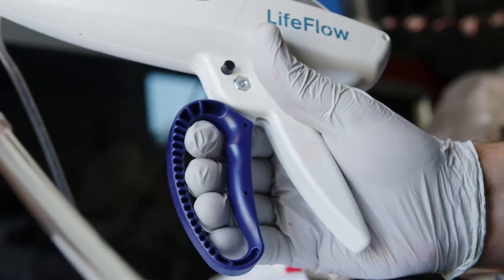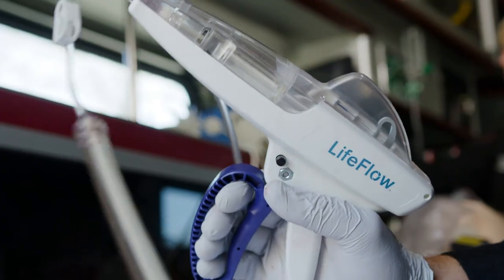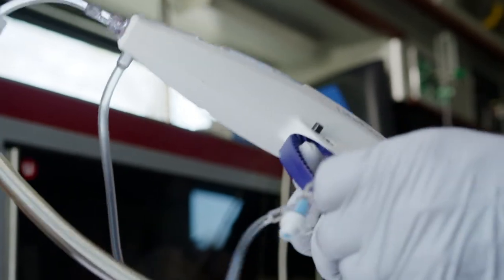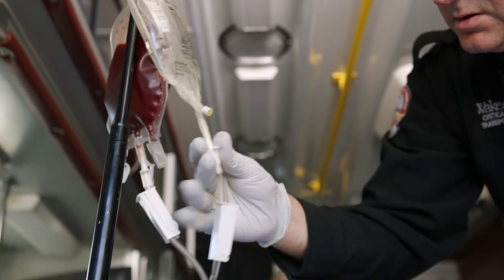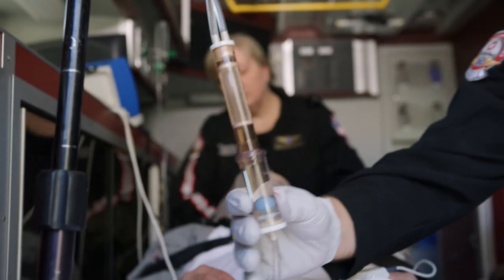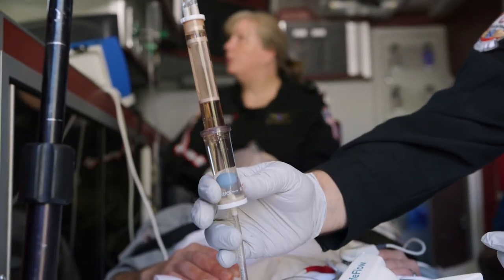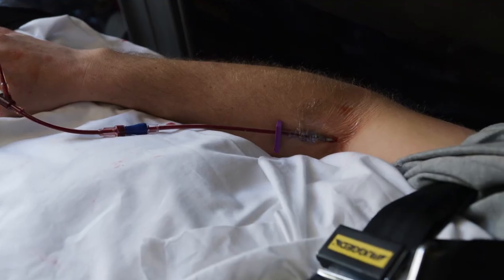If the trigger loop stops moving, do not force it open or closed. Stop infusing and begin troubleshooting at the top and move down: check that fluid remains in the desired bag, ensure that roller clamps are open, check that the filter is not clogged, make sure the ball is not suctioned to the bottom of the air check, and check all distal clamps.